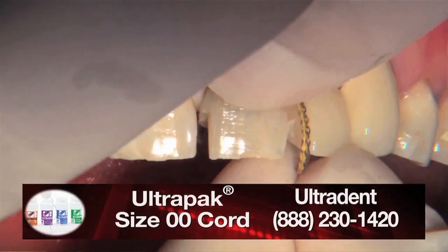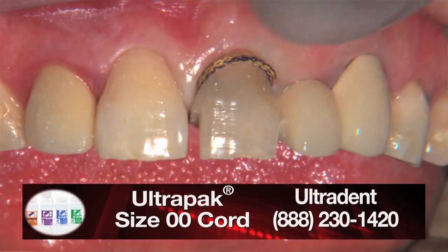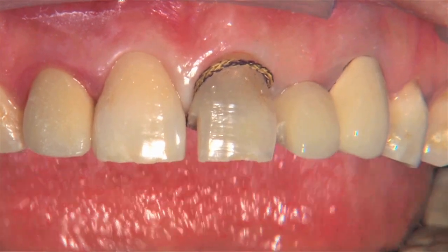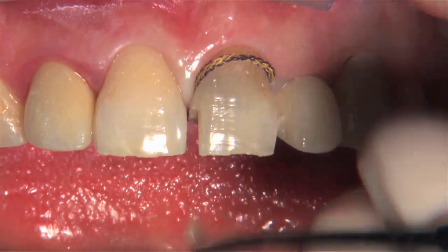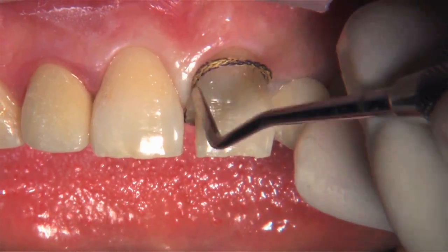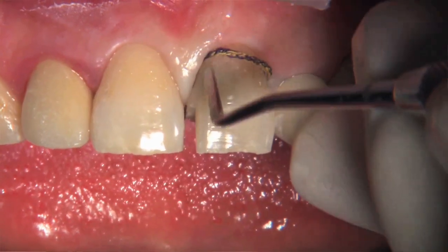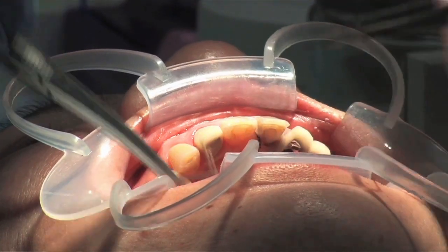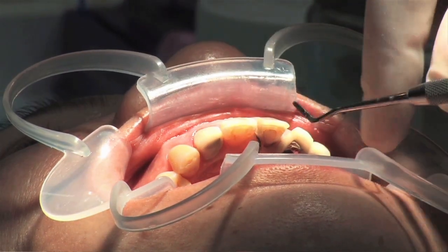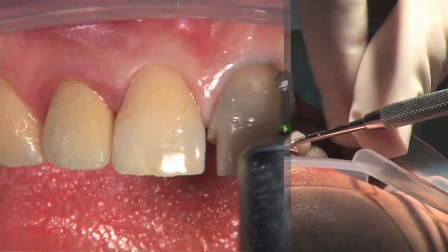I'm going to just take it and place it on the mesial and the distal of this tooth, and then pull the two loose ends towards the lingual, so that the facial portion of the cord gets close to the tooth. And once it does that, I'll use my cord packing device, a non-serrated device, to get this Ultrapak double zero cord from Ultradent, a hollow braided cord, down into place. And then on the lingual, we're going to cut the two ends so they sit flush to each other. I don't want them to overlap at all, because we're going to place another cord into the sulcus by the time we're all done.